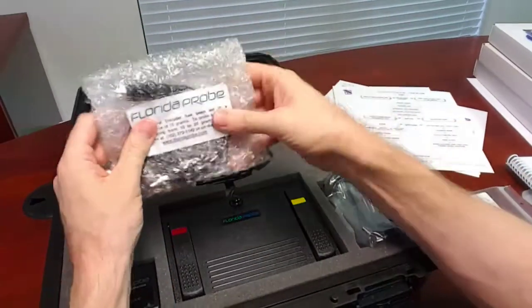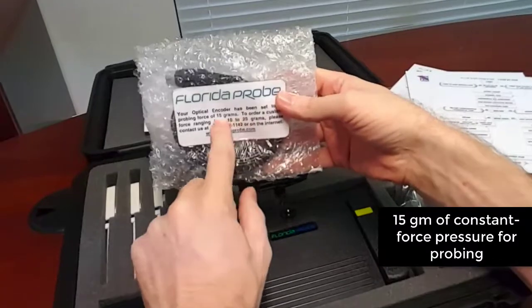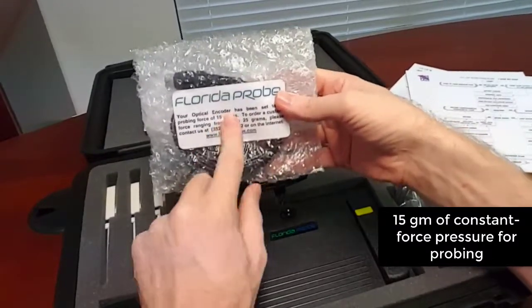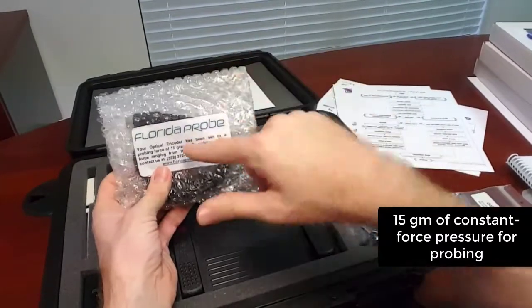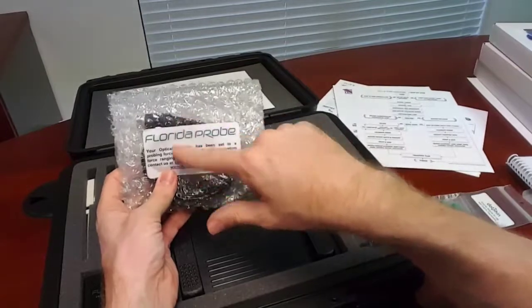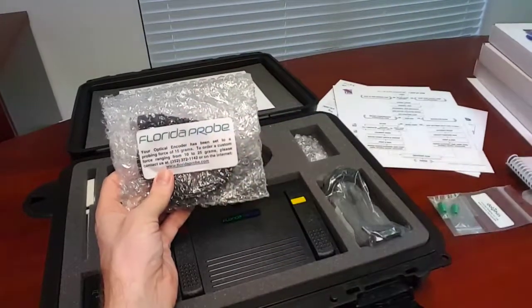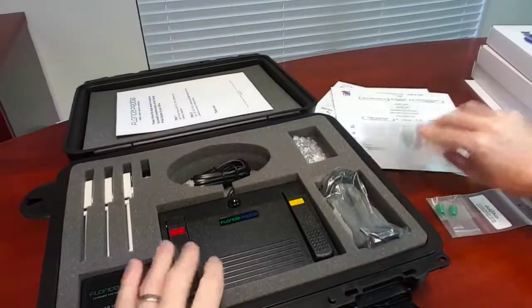So we have our optical encoder. This one has been set to 15 grams of constant force, though you can order it at 20 grams. Sometimes research projects require a specialized pressure, so this is standardized. All the pressure for the probing is set in the encoder cable and not in the hand pieces directly. We'll take this out and look at it in just a second.